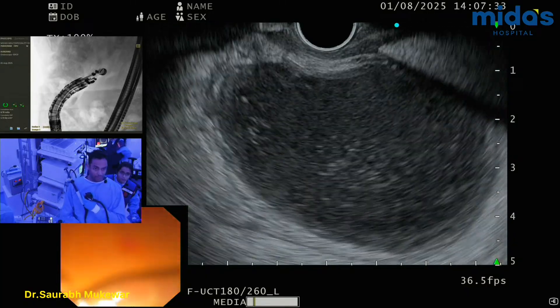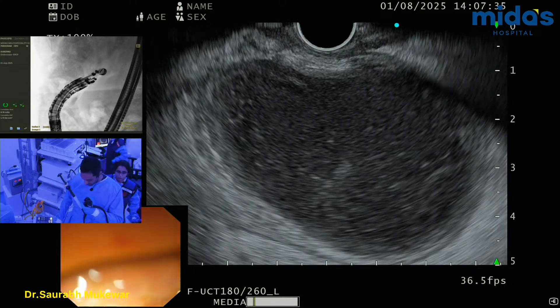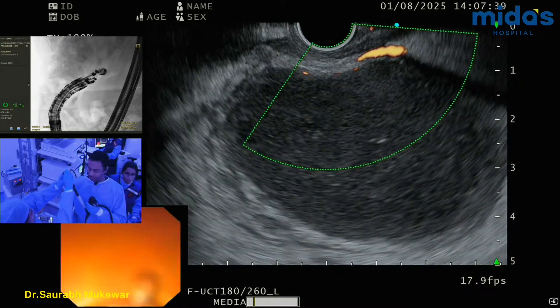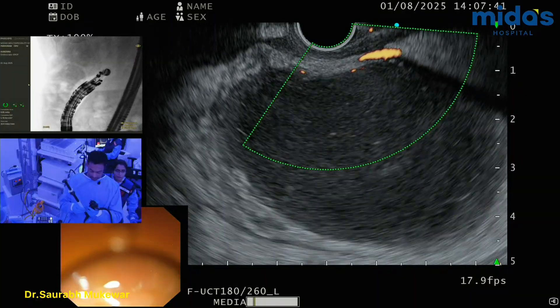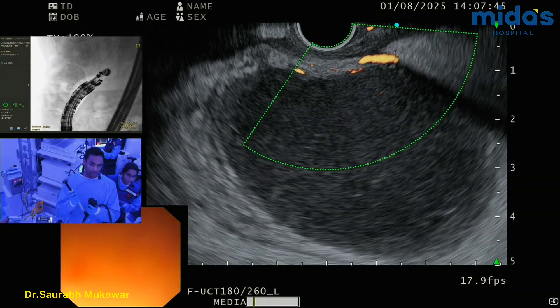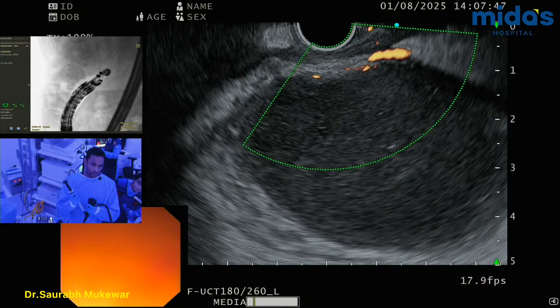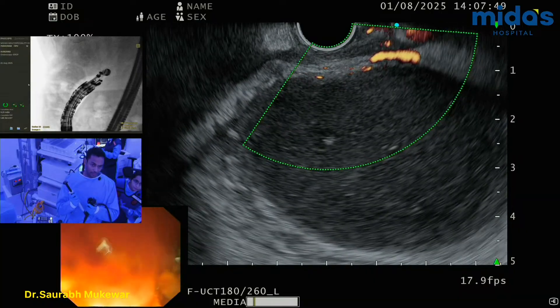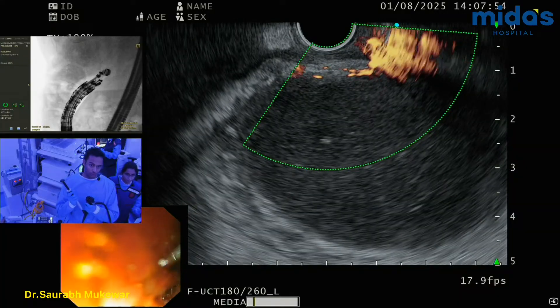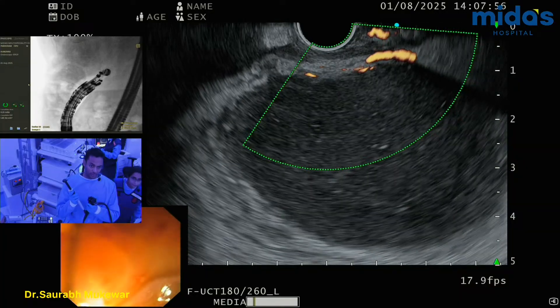Because from there, any cholecystoscopy is very hard. Antrum is okay. So first thing I'm going to do is push it out to see where it's coming from. I'm not doing any cautery — and see, it's coming from here. There are obviously not a good place because of so many vessels here, right? So I'm not going to touch there. Let's find another spot.